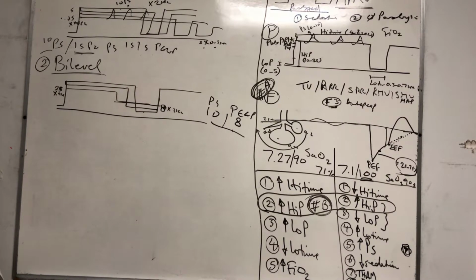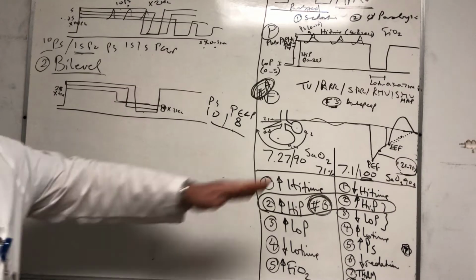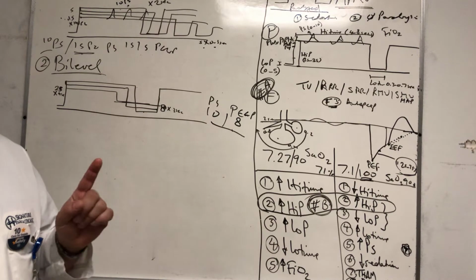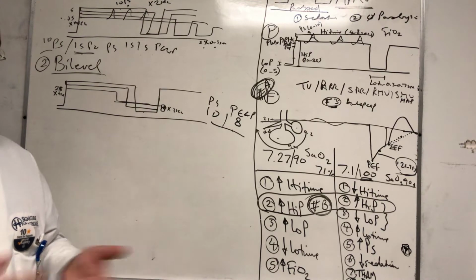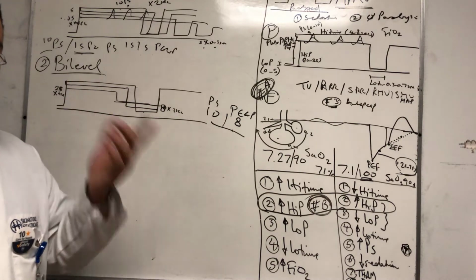All right, so it's the low time. Remember we said, if the low time increases, then the lung reaches the baseline and you'll start seeing the low pressure. If the low time becomes 1 second or more, right? I made this up, by the way. There's no guidance, but somebody has to come up with something, otherwise we'll go crazy.